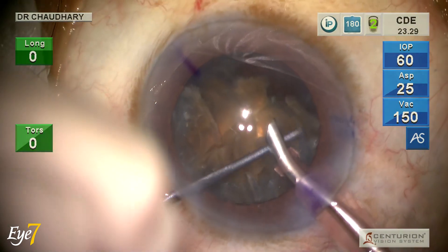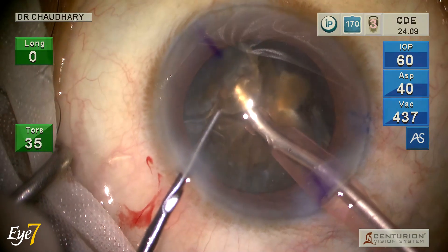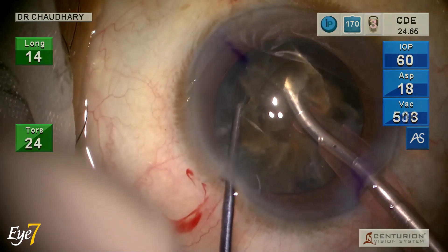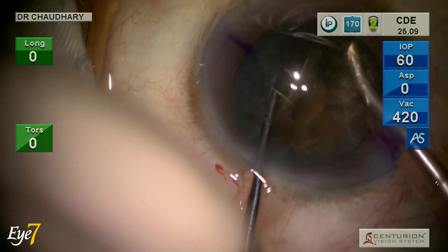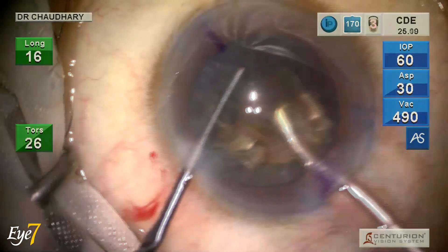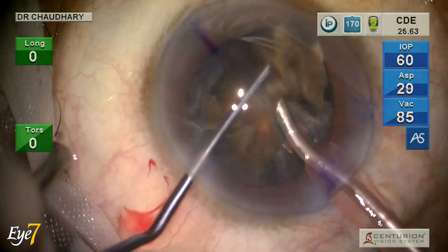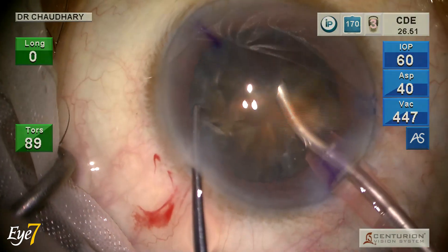On the top right corner you can watch the CDE — cumulative dissipated energy — moving. I have reached 24.5, which is good for such a hard cataract. IOP is fixed at 60. Aspiration flow rate and vacuum both peak out at foot pedal 2. I pick one piece at a time, bring it to the center, and emulsify it.